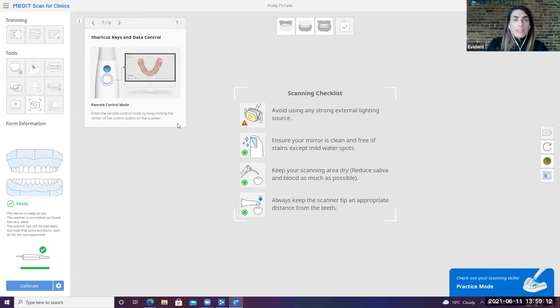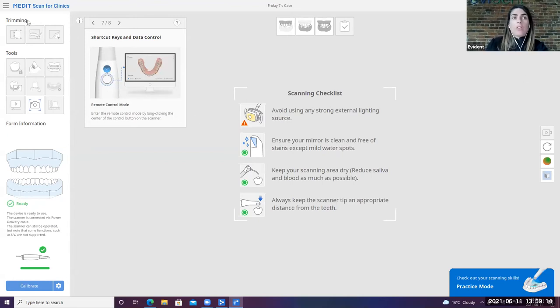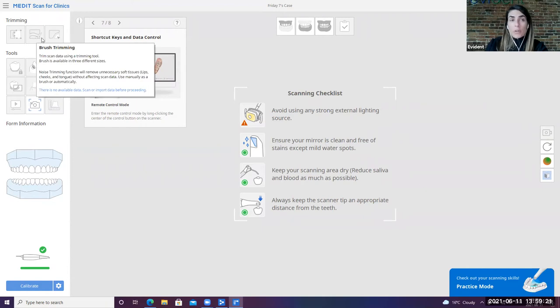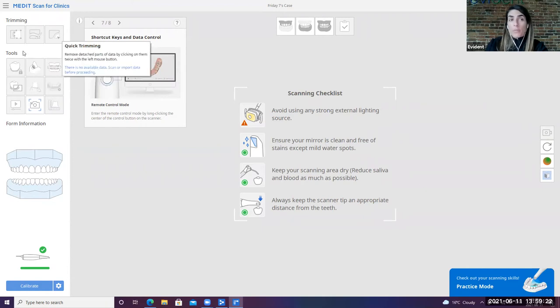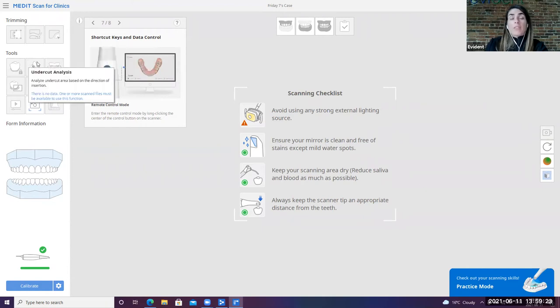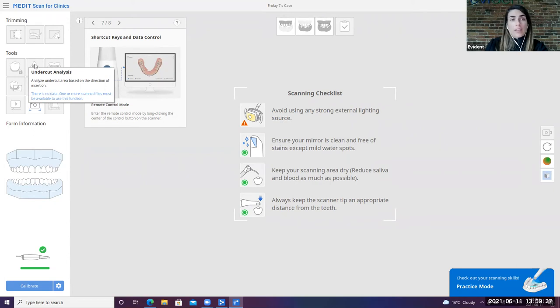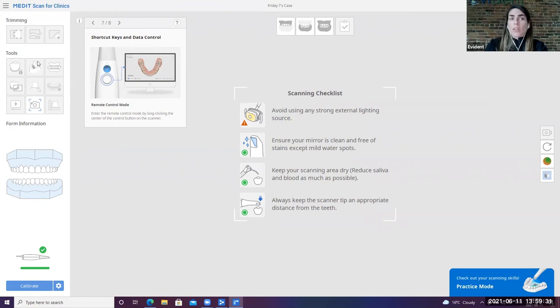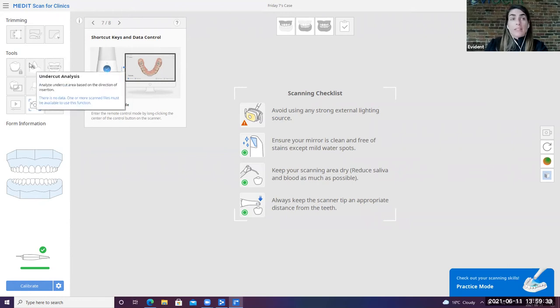With regard to the eye scan screen that we have here, again, on our left-hand side, we have a variety of different tools. We have three different trimming tools. You can do a larger trim, a smaller, more specific trim, or just a quick trim, as well as you can check your undercuts. This is especially important when you're dealing with crown and bridge cases, or if you're dealing with a night guard, you want to see how retentive something is, then you can take a peek at the undercut analysis.